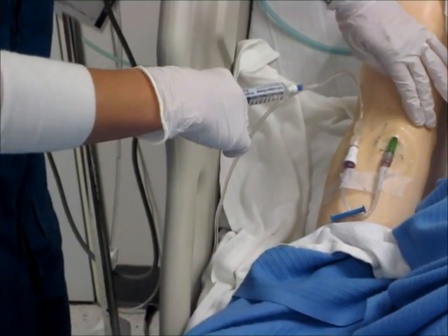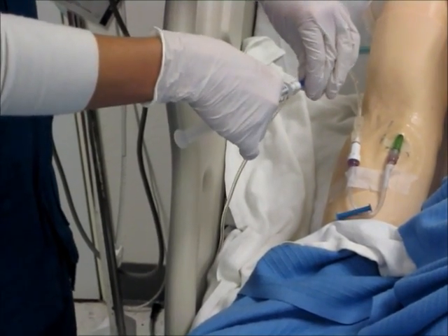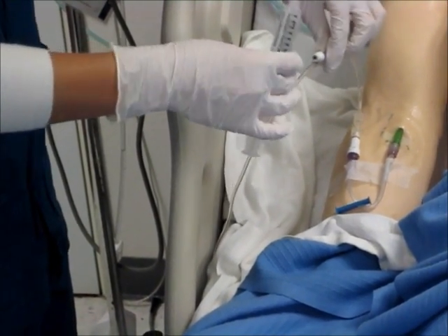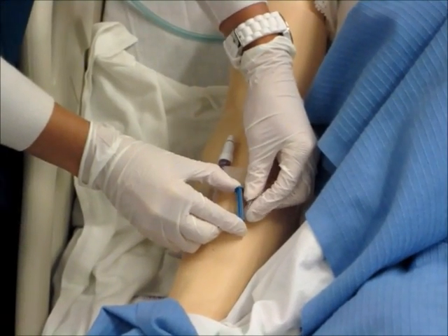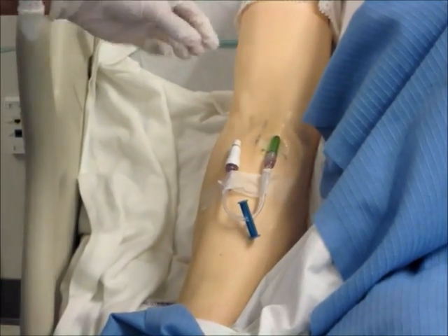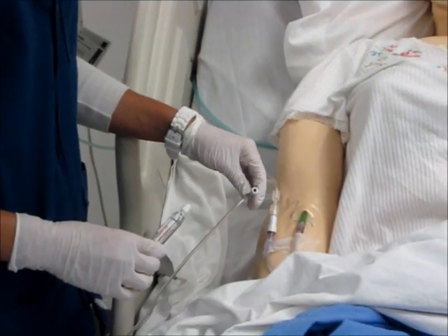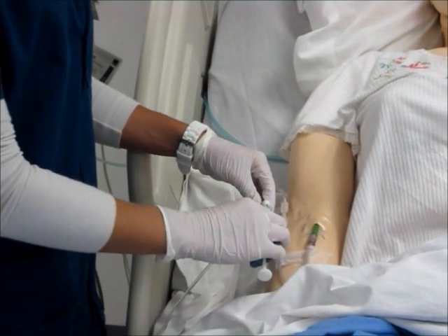If there is no blood return when aspirating, or if there is difficulty injecting the saline, the nurse will need to discontinue the peripheral site. For a saline-locked IV, the nurse will unclamp the saline lock and do the same procedure as with a running IV infusion.